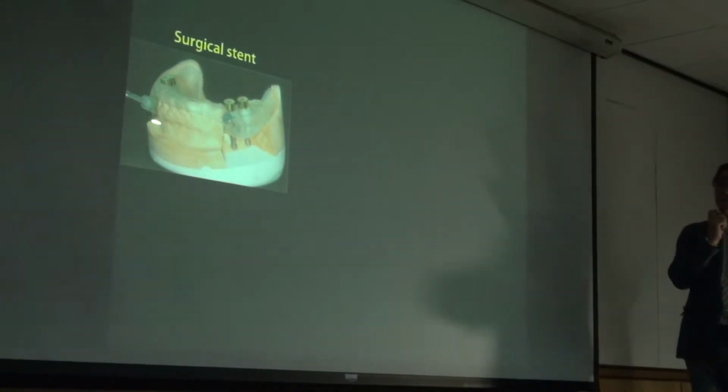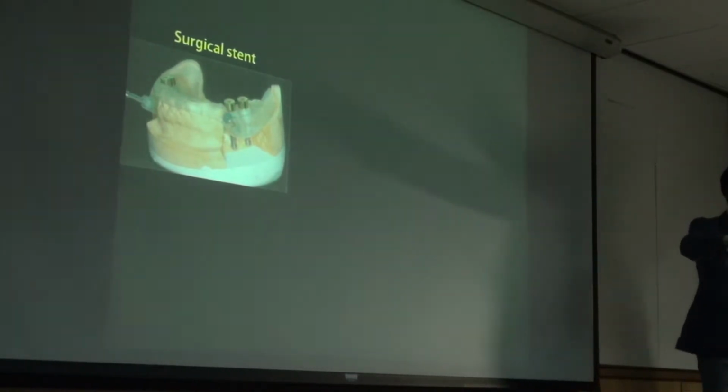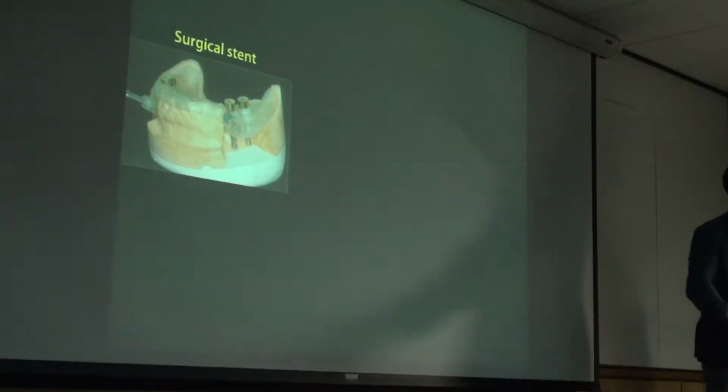After that, they make some holes on the radiographic stent and then put in some metal links.